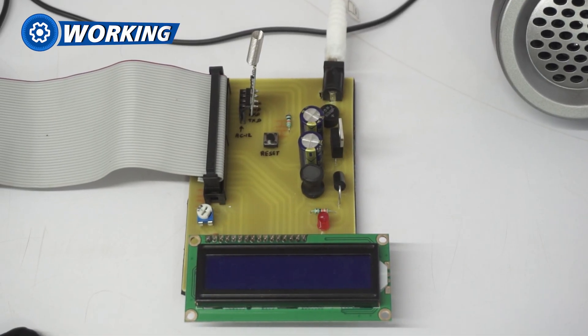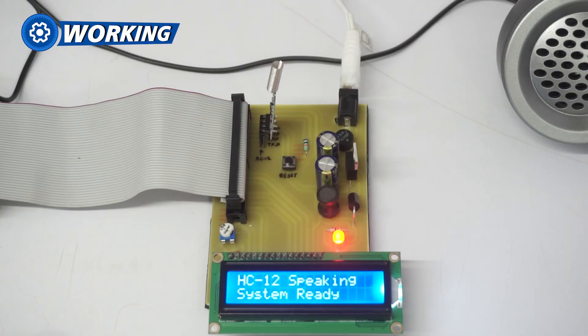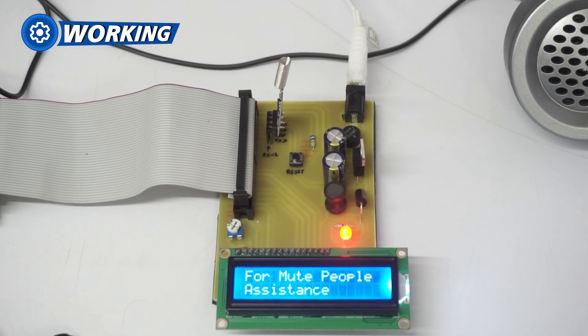When power is supplied to the PCB, the power LED will turn on, indicating that the system is active.